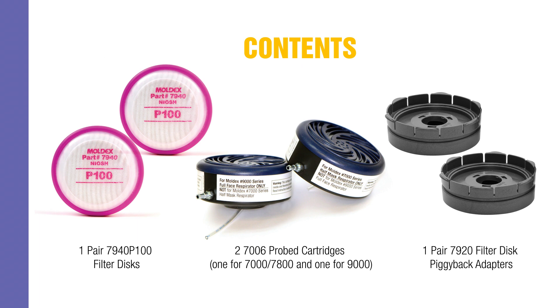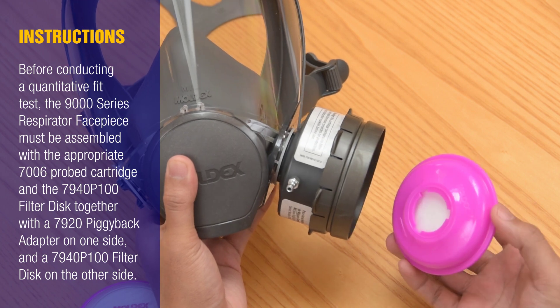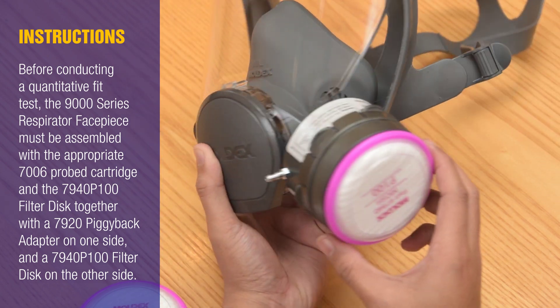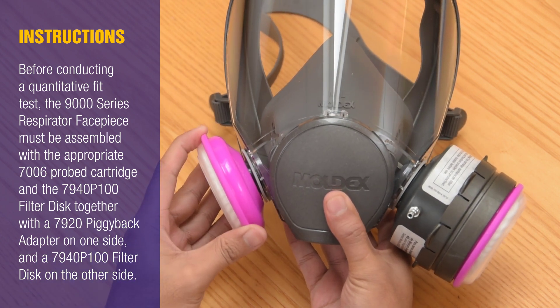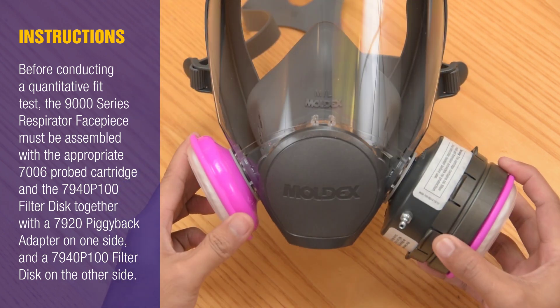Also included: one pair of 7920 filter disc piggyback adapters. Before conducting a quantitative fit test, the 9000 series respirator face piece must be assembled with the appropriate 7006 probe cartridge, the 7940 P100 filter disc, and a 7920 piggyback adapter on one side, and a 7940 P100 filter disc on the other side.